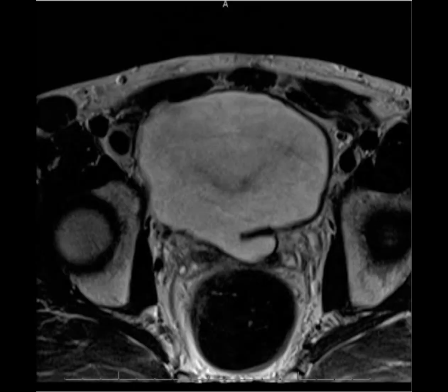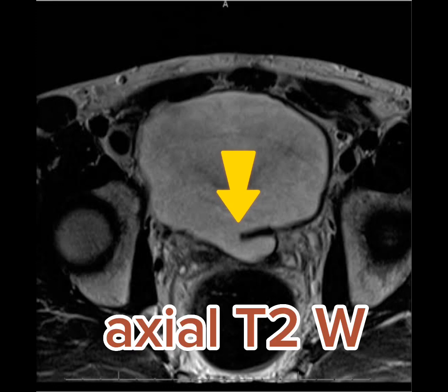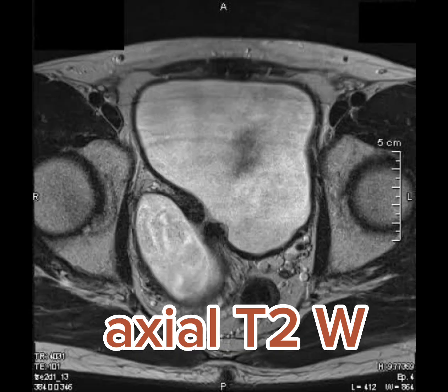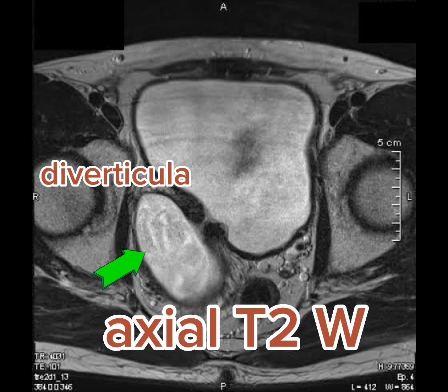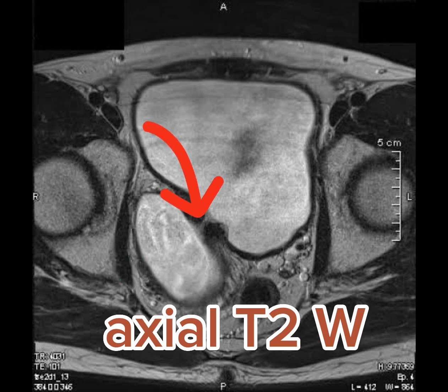Now we will see a few more examples of MRI of the pelvis showing diverticula. In this image we can see an axial T2-weighted sequence with a diverticula along the posterior wall of the urinary bladder. Another example of axial T2-weighted sequence shows a prominent sized diverticula from the right posterolateral aspect of the urinary bladder, with a very narrow neck clearly appreciable between the bladder and the diverticula.